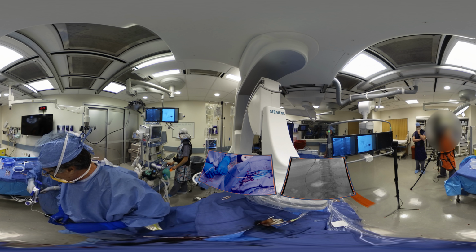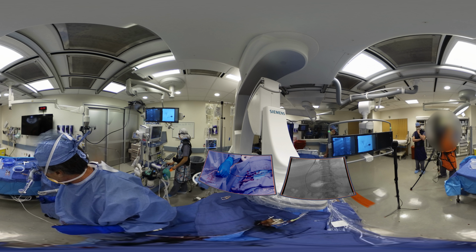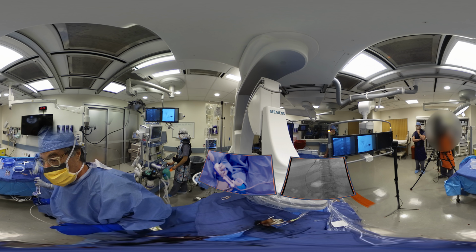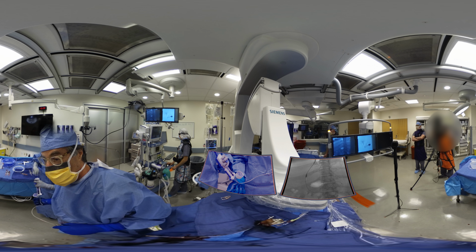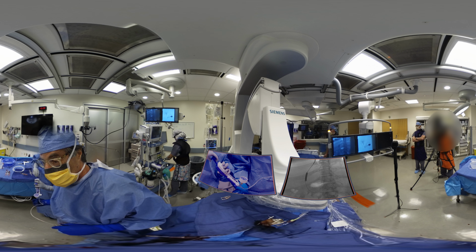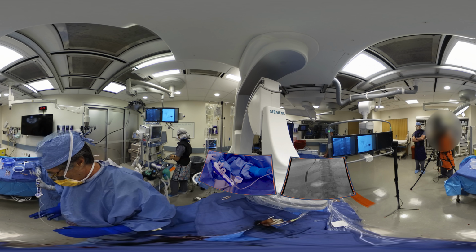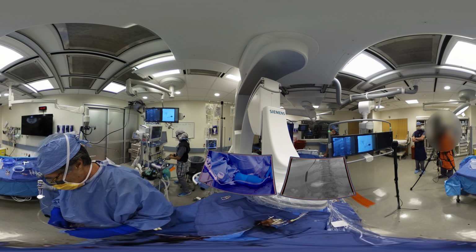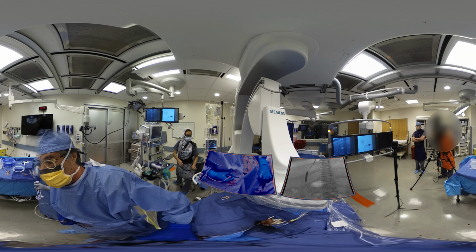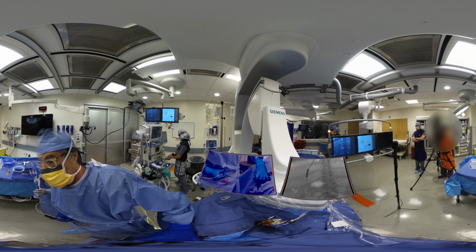We'll make an estimate there. Great. Please go up in pressure. I can hold the wire if you'd like. Great. Let's take it all the way up to 12 or 16 atmospheres. 12. Okay, and I think we're at the very bottom of the portal vein, so entry site. So we'll deflate.